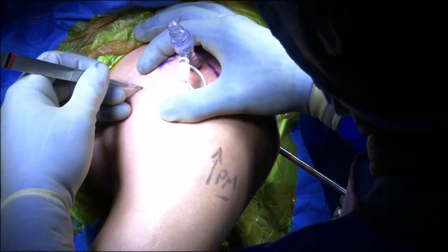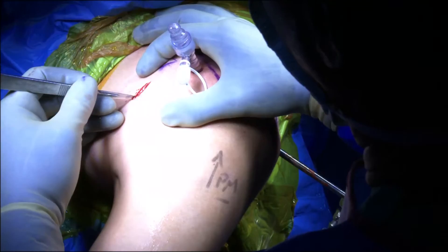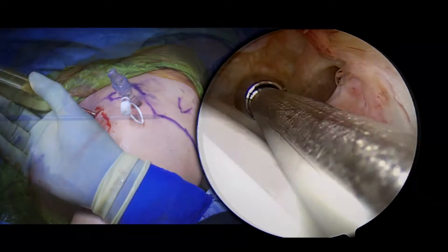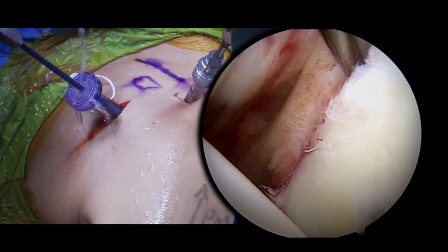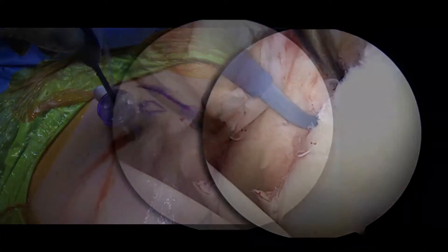An accessory anterior inferior portal just above the upper border of the subscapularis tendon is placed, followed by the placement of an 8.25 millimeter cannula. A hooked electrocautery device is then used to further elevate the capsulolabral sleeve in a superior direction to facilitate mobilization.